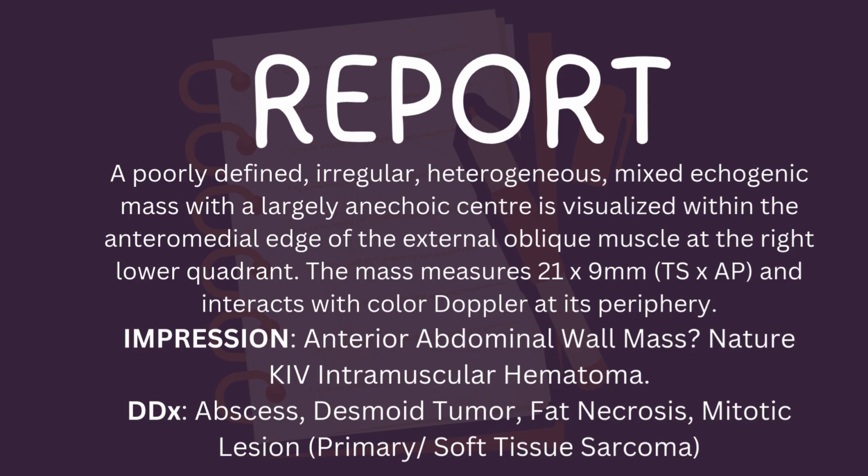Now, because of the wide range of possibilities this mass could be, I didn't fail to include some differentials, which would include abscess, desmoid tumor, fat necrosis, or more sinister lesions like sarcomas.